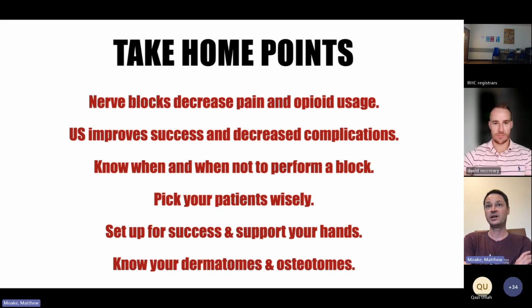I do think early on, when you're getting nerve blocks going, my nurses know how to set up for a ketamine sedation really quickly. Whereas with nerve blocks, sometimes it takes some time to collect the things, and they don't really know what to set up or if they need to be involved. But once you get going with it, get your supplies, get kits built, it can really facilitate the timing. And it's a lot of culture change.